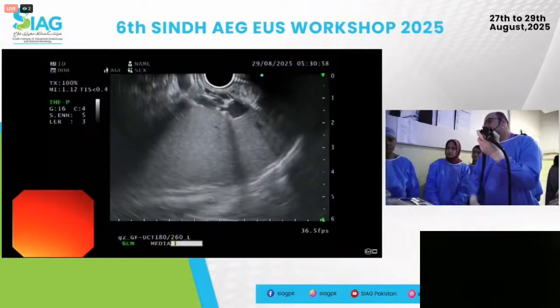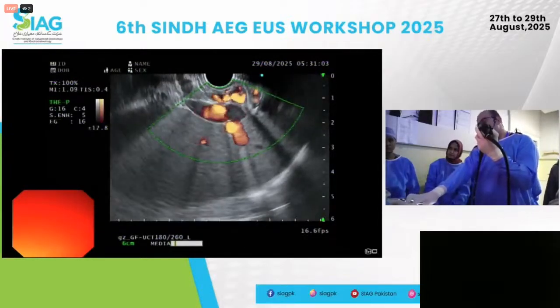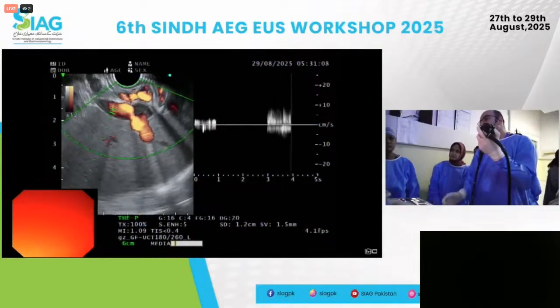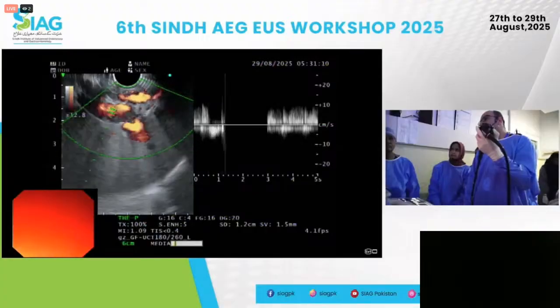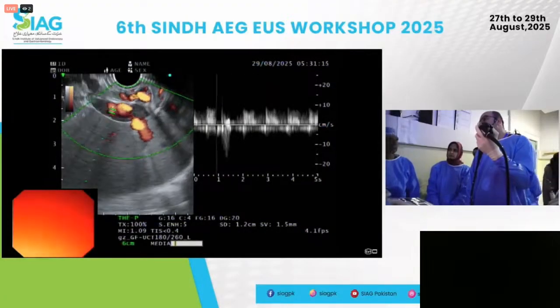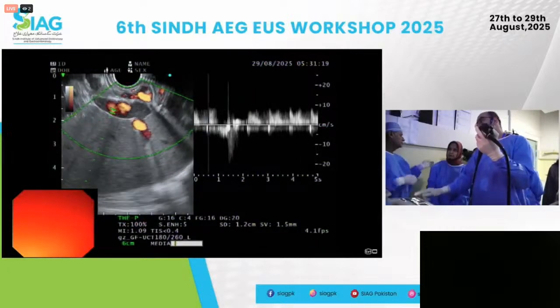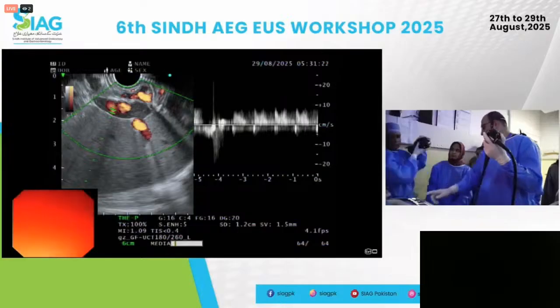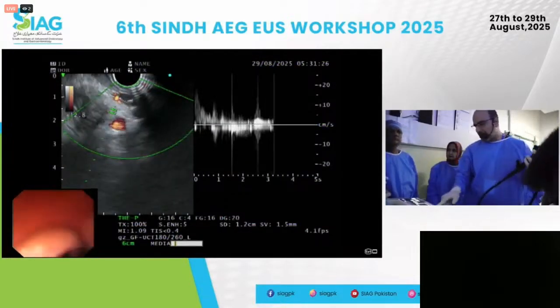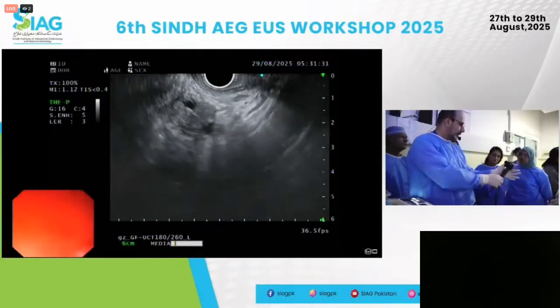Okay, and this, we can try here. This is one big vessel. So we'll do flow here. It's okay to take your time on these things and study them. There's no rush to complete your exam, because this is why this patient's here. And look at this. This is your classic flat waveform. When the breathing is stable, you can see that that's the flat waveform towards the right of the screen, and that's your venous. Exactly. So yes, we expect this patient to have splenic vein occlusion, and we are seeing collateral vessels.